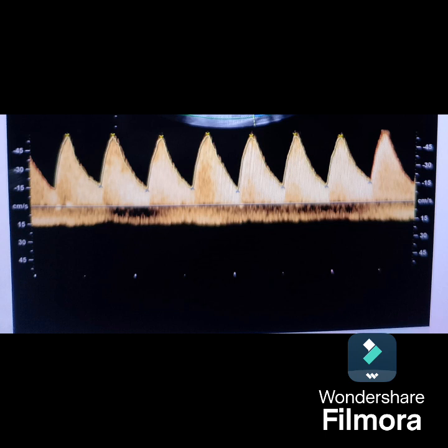Now same thing when the end diastolic flow is present, only pulsatile indices are high. Here also the same, we continue Doppler every 15 days and deliver at 37 weeks. And 34 weeks, same, when there is no growth on scan for 3 consecutive weeks.